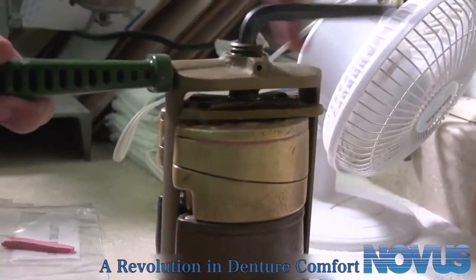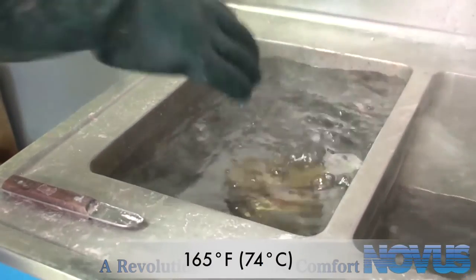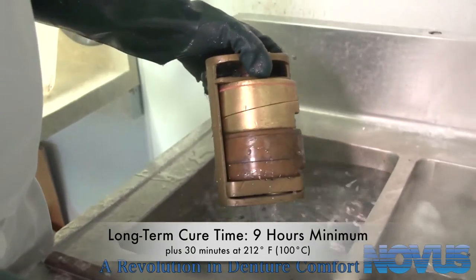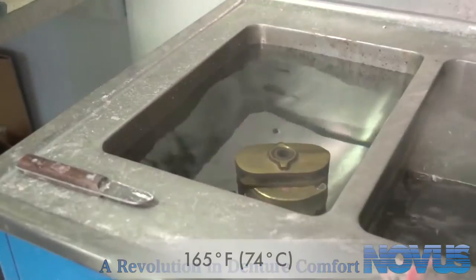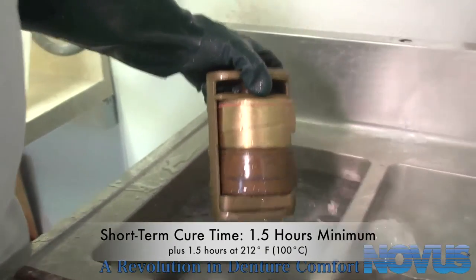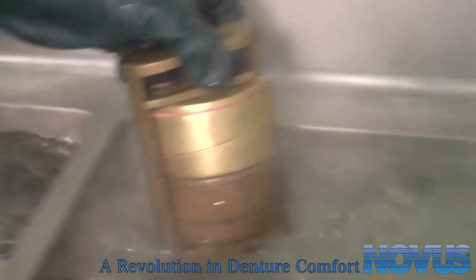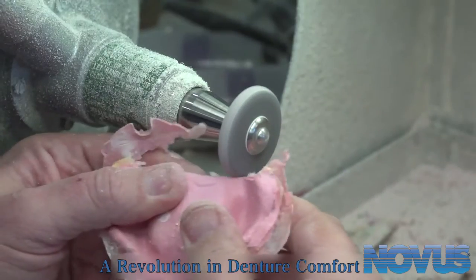Next, clamp the flask shut and place it in a curing tank preset at 165 degrees Fahrenheit, 74 degrees Celsius. For a long-term cure, the cure time is a minimum of 9 hours, with an additional 30 minutes at 212 degrees Fahrenheit, 100 degrees Celsius to complete the curing. For a short-term cure, the cure time is a minimum of 1.5 hours, with an additional 1.5 hours at 212 degrees Fahrenheit, 100 degrees Celsius. When curing is complete, open the flask, remove the denture with Novus Bond applied, and finally clean and polish the denture for delivery.